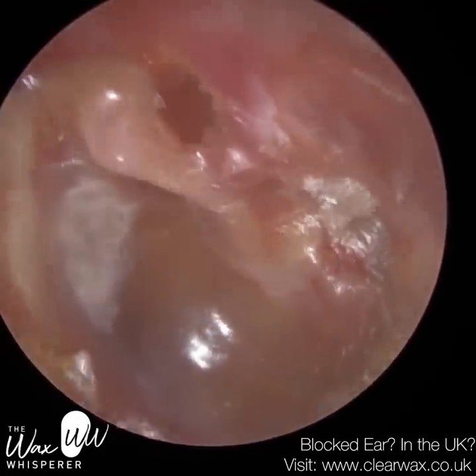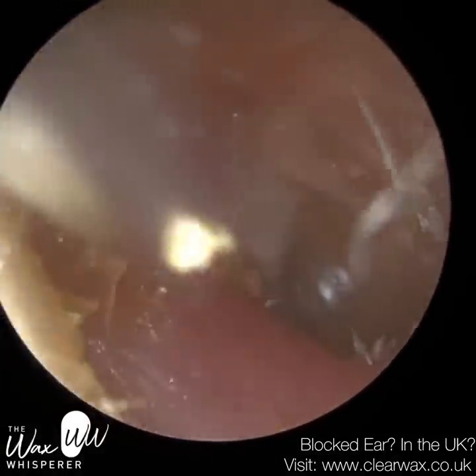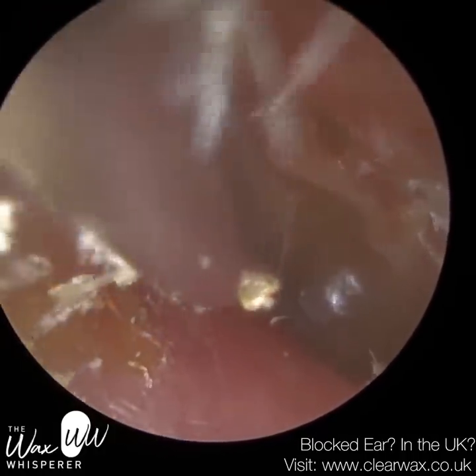This patient's ear is generally quite dry, causing the skin to become quite dry. When you've got dry skin like this, patients can find it very itchy and irritable because it's crusted like shards of glass. When you move your jaw, you can feel that skin — it's so tight and constricted. It can rub and abrade the canal wall, so it can be uncomfortable for the patient.